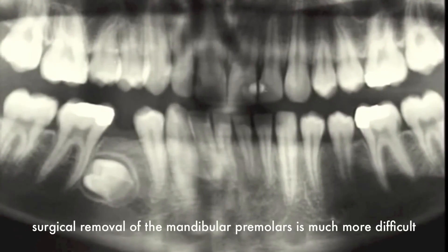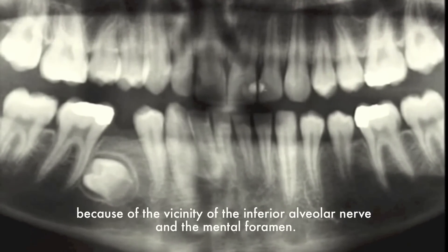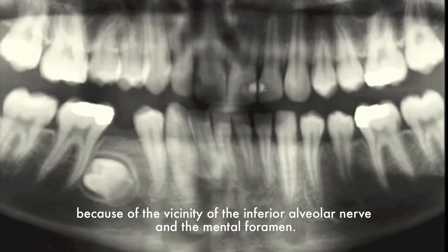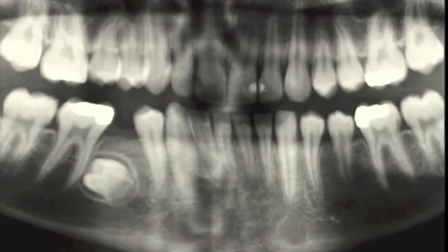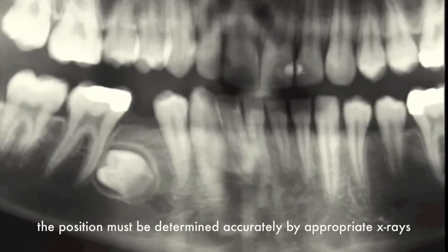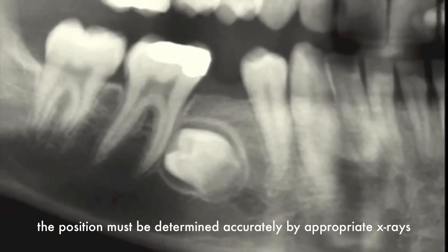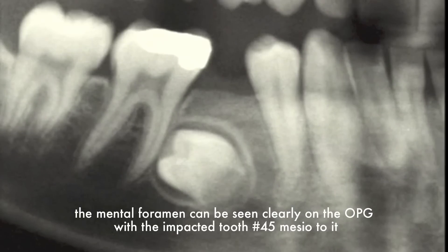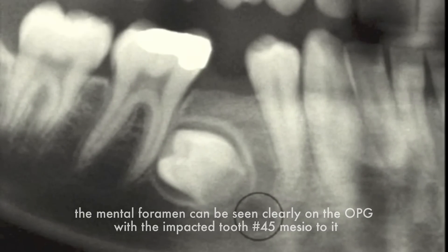Surgical removal of the mandibular premolars is much more difficult because of the vicinity of the inferior alveolar nerve and the mental foramen. Before the operation, the position must be determined accurately by appropriate x-rays. The mental foramen can be seen clearly on the OPG with the impacted tooth 4-5 mesial to it.